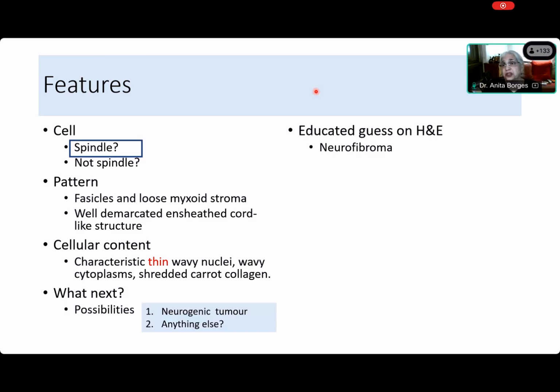Have you ever seen a schwannoma? And that's what I'm telling you. You guys do not make observations. This is the thin, wavy nucleus. You have never seen it in a schwannoma. You will never see it in a schwannoma. Can this be what we call plexiform neurofibroma? Yes, it is quite right. It can be a plexiform neurofibroma because it is in those bundles, and they have a sheath around it. Okay, excellent. All right, so it's a neurofibroma.